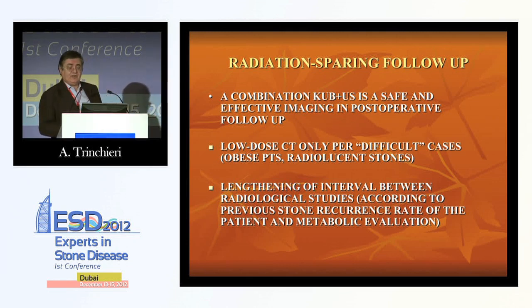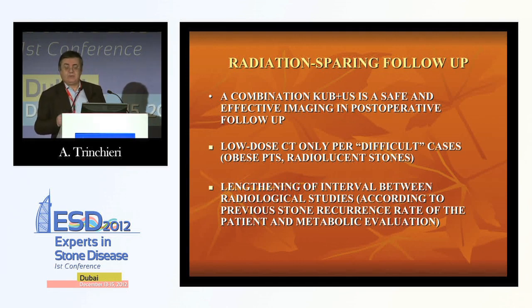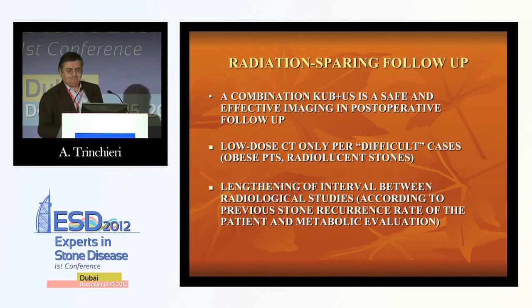Another option that you have to consider is to tailor your follow-up in relation to the previous recurrence rate of the patients in order to lengthen the interval between the radiological studies, and in this case also to reduce the exposition to X-ray.